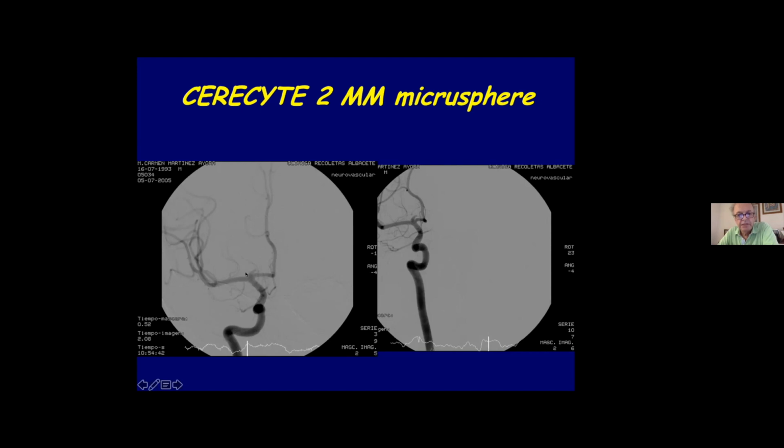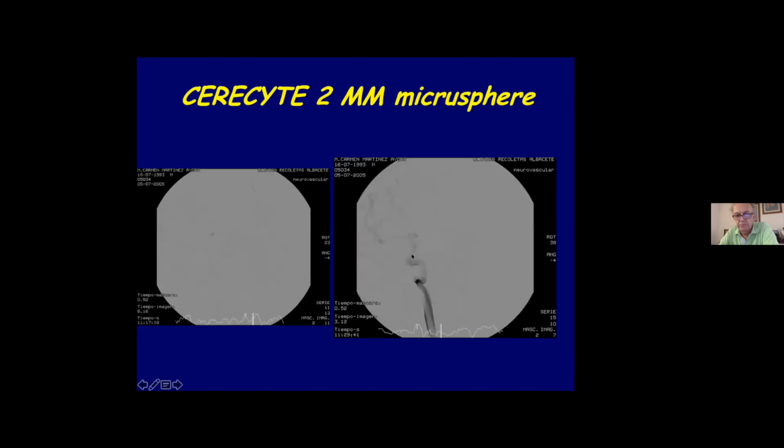This is the blister aneurysm, large neck, and a small fundus. Oblique projection, catheterization, and coiling, and protect the aneurysm, and the patient is well.